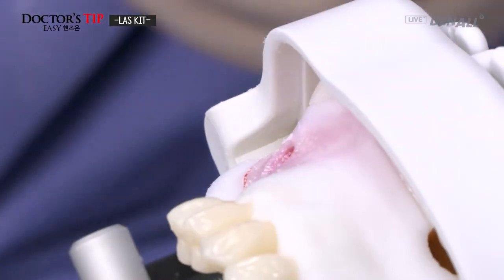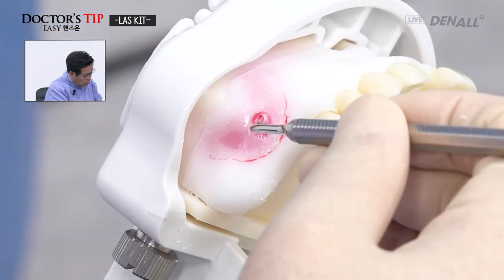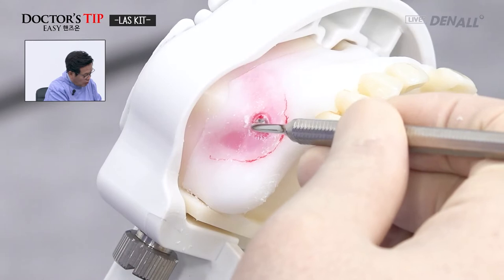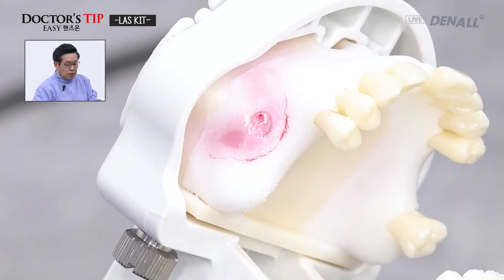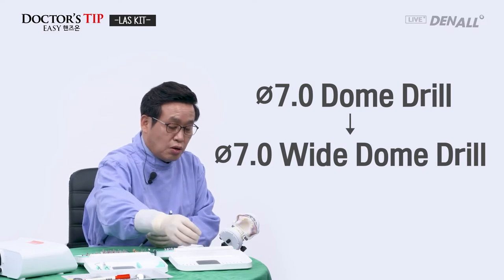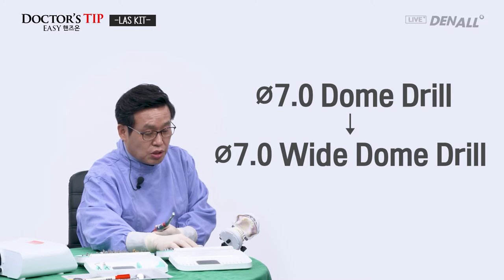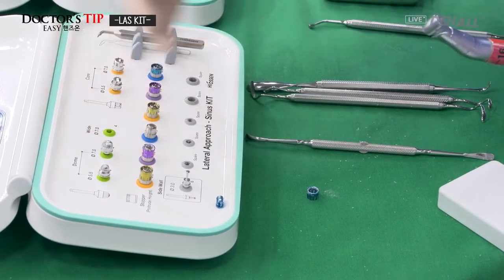And as you can see, with the 1.5 stopper, you see the sinus on the lateral wall side, a bit of perforation. So that's it. I think 1.5 is sufficient. Then the hole is a bit on the narrow side, so we now opt for the wide dome drill, 7.0 diameter, but it's a bit wide on the front.